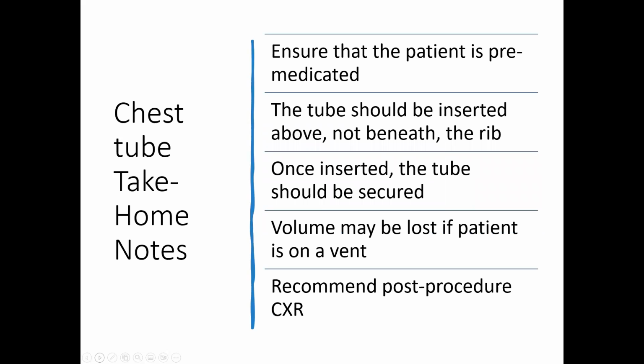Take-home notes: ensure that the patient is pre-medicated. There's a lot of tissue that's very well innervated, so it'll be very painful. If anyone has broken a rib or bruised a rib, you'll attest to this. So ensure that the patient is pre-medicated. Many times when they're putting in the tube, they will not just give some sedation and pain medication to the patient through IV, but they'll also use a local anesthetic.